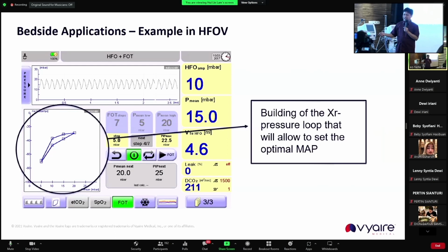9 atau 11. Nanti grafiknya kan kelihatan nukik ke bawah. Kalau nukik ke bawah itu tandanya over distensi. Kita jadi ambil yang ini. Kalau enggak, ya terus lagi yang paling atas, yang tinggi, terus sampai ketemu gambar nukik. Nah, seringkali yang saya kerjakan pada FOT ini pasiennya udah ngembang. Nanti dapatnya enggak kurva seperti ini, kurvanya langsung turun ke bawah. Jadi sebenarnya parunya sudah mengembang.